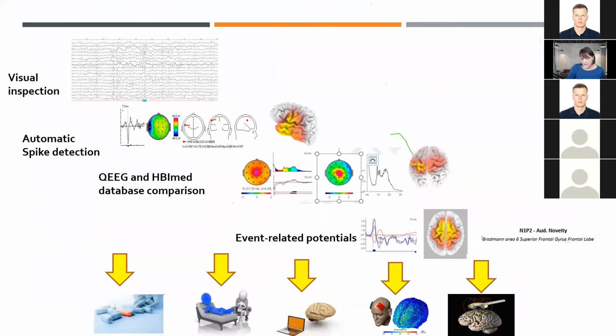So all of this presentation is just to tell you that if you have a real case and the person comes with ADHD and tells you that he has abnormal response to medication or maybe some severe side effect, in this case quantitative EEG analysis and ERP analysis can help you to understand your client better and maybe suggest some specific therapy. You also can create an individual approach in neuromodulation or psychotherapy, whatever you are using in your everyday practice.